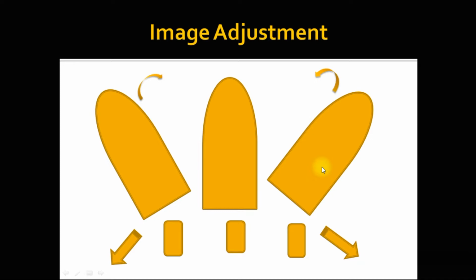One more time, when the ventricle is oblique toward the right side of the screen, you have to move your probe downward one space and laterally, in the anterior axillary line for example, then your oblique image will look like that. In the same manner, when the ventricle is oblique to the left side, you have to move your probe medially and downward. Then the ventricle will move to the center of the screen.